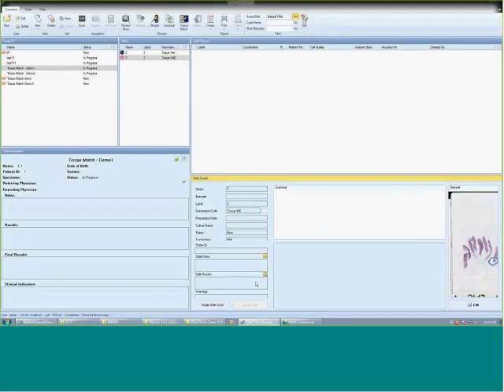You are now viewing a screenshot of the Genesis software. For this demo, I have already scanned the H&E and FISH slides, so they are waiting for us in the database. But should anyone wish to see how Genesis creates the tiled images, please send me a note and I'll arrange for a private demonstration.